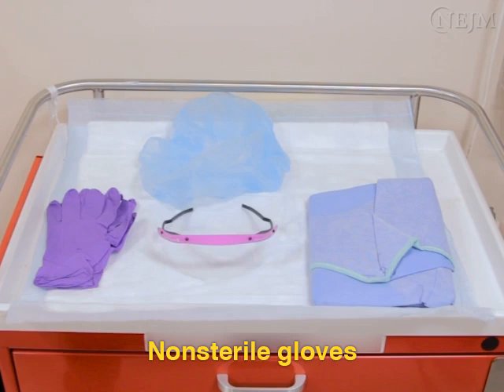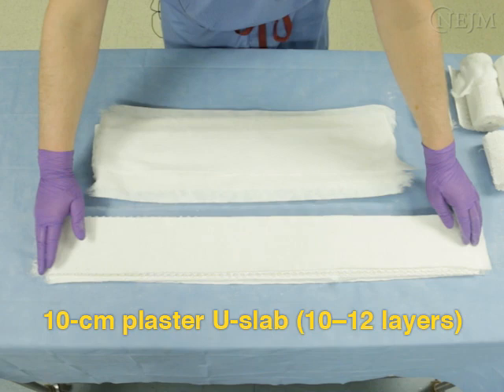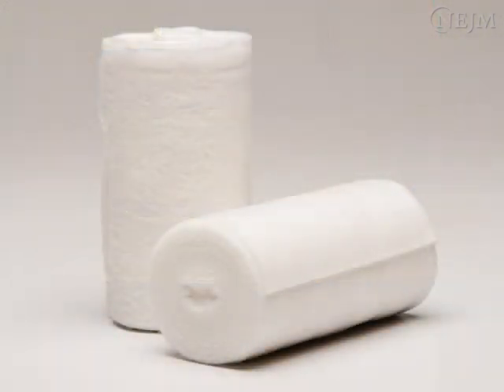For splinting, you will need non-sterile water, non-sterile gloves, a non-sterile gown, a cap, a face shield, and splinting material. Lay out the splinting material, which consists of a 10 centimeter plaster U slab with 10 to 12 layers, a 10 or 15 centimeter plaster posterior slab with 10 to 12 layers, and adequate padding such as cotton undercast padding material.